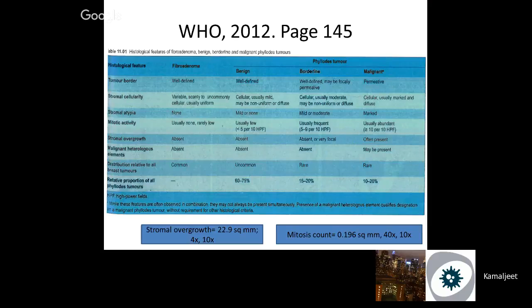I think there is good agreement in diagnosing malignant phyllodes. Beyond that, people can go in every different direction, but I think boards will keep it simple if they do give you a fibroepithelial lesion. So we'll just go over a few cases and see how we get to this grading of phyllodes. I'm not going to show you a fibroadenoma because we see fibroadenomas a lot, but phyllodes are rare and we don't see as many.